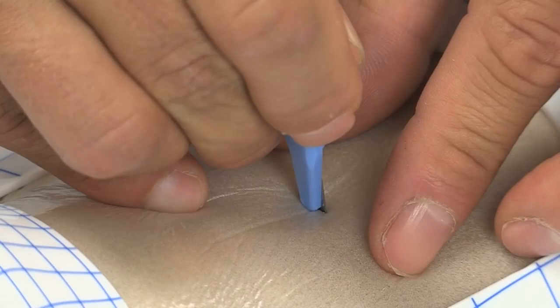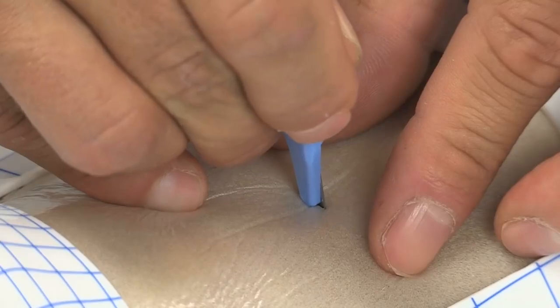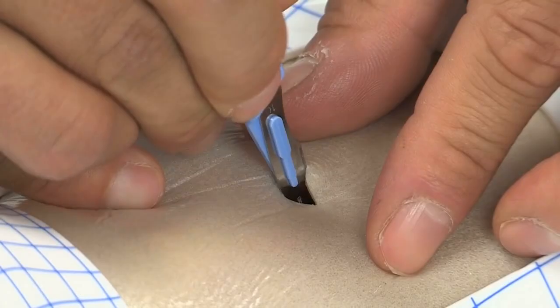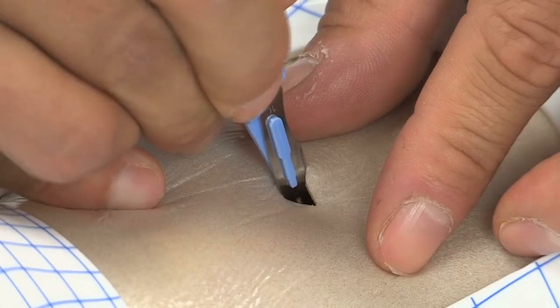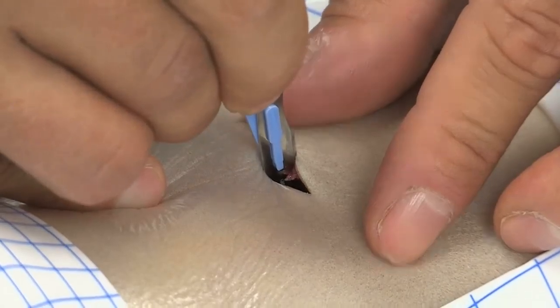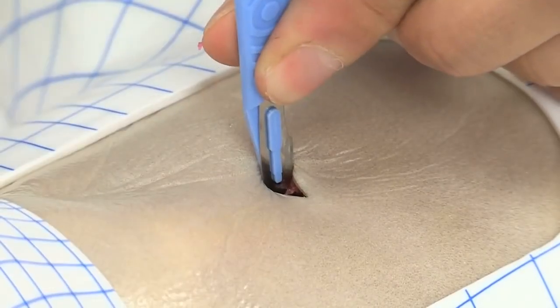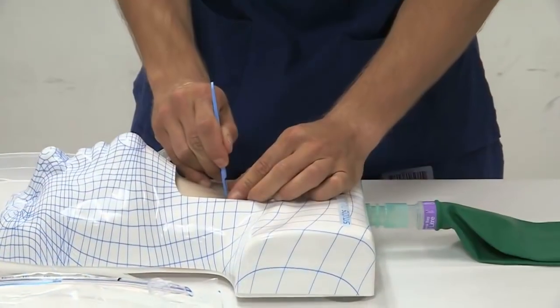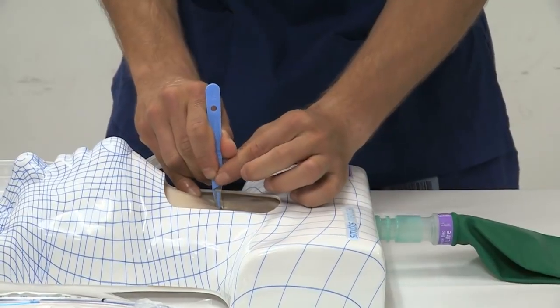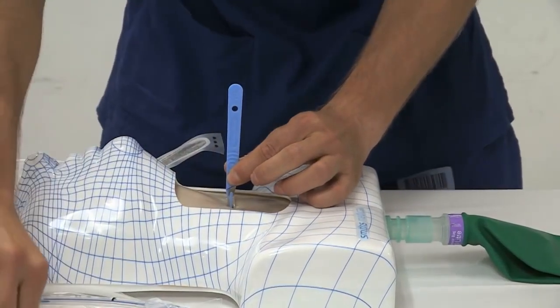After feeling a pop as the blade enters the airway, gentle traction should be applied to the scalpel before it is rotated 90 degrees with the blade sharp edge ending up pointing caudally. While maintaining perpendicularity, the blade should be pulled towards the anesthetist, producing a triangular hole in the skin and underlying airway. The operator should now switch hands so that the non-dominant hand holds the scalpel.